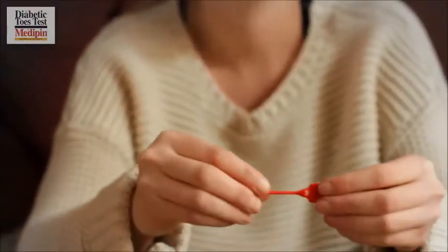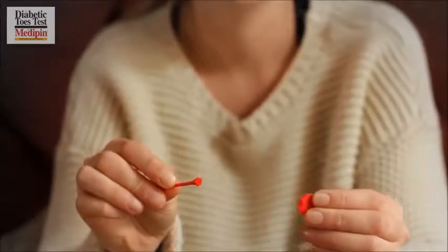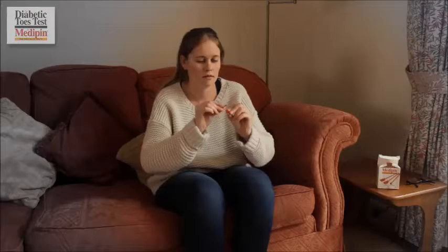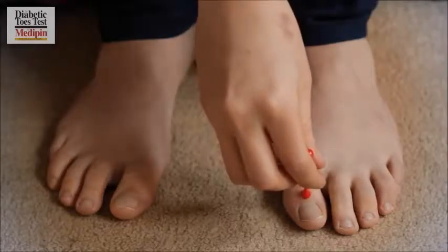Number one: first grasp the Medipin between your thumb and finger and snap the tab to expose the point. Next, and as in the picture, gently press the point onto your big toe between the knuckle and nail with just enough pressure to dimple it.